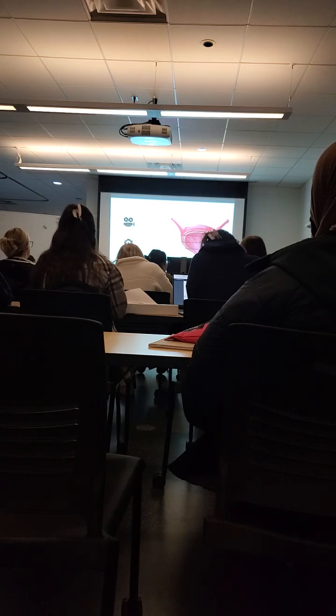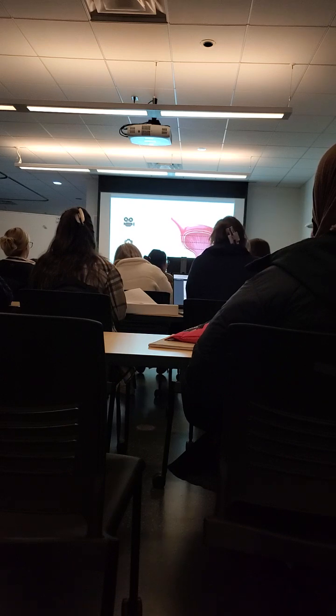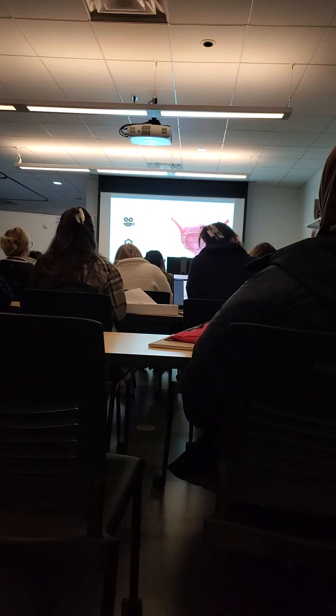Good questions. Could you take your images from your video? No, you can't, not unless you do it right then and there. Because you can take your cine, but they don't want you to take a cine and then get your images. I would say in a pinch, but I would try not to do that, because they're gonna show movement and you won't have a clear image.